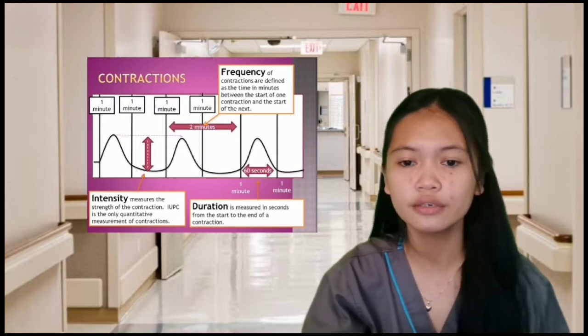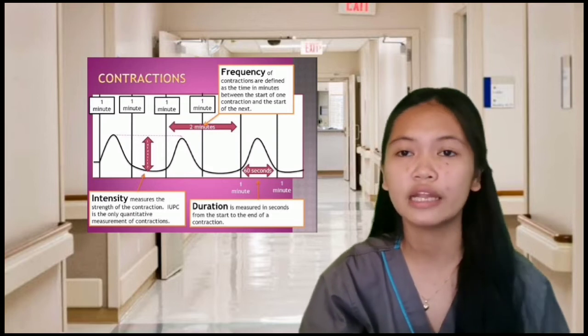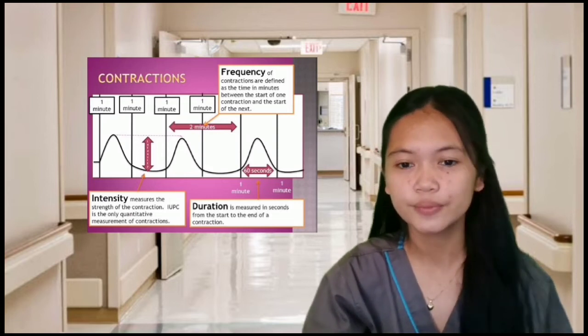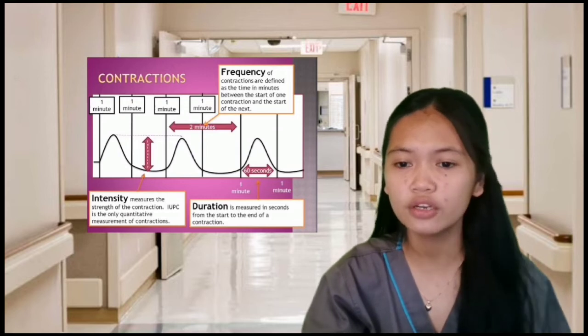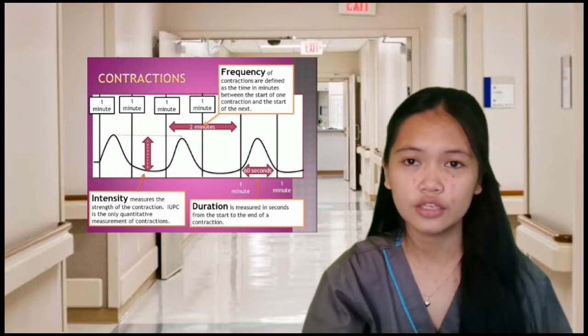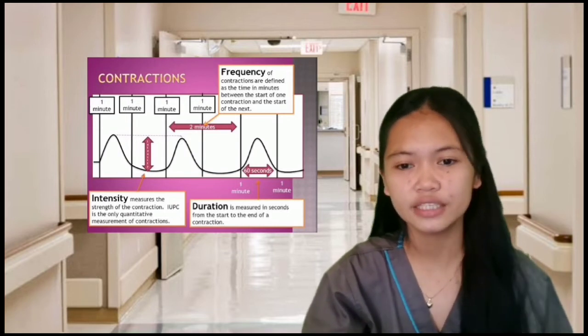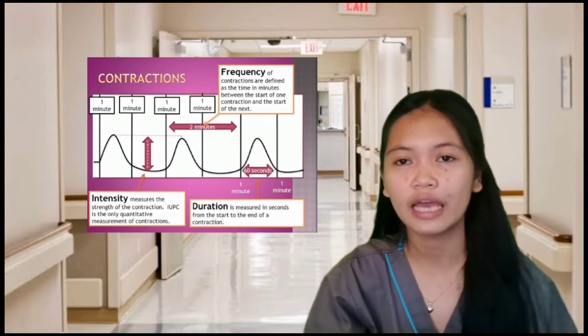In a normal labor, one contraction every 2 to 3 minutes, or less than 5 contractions in a 10-minute period, is ideal. A uterus must rest between contractions, having sufficient uterine resting tone, a softer touch, and uterine resting time of about 1 minute. Contraction intensity can only be assessed with IUPC.